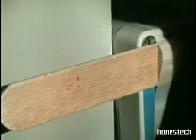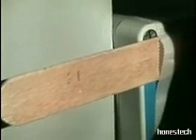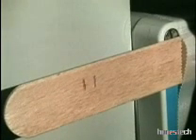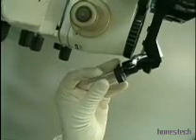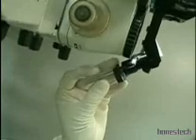Thanks to the AccuBlade, irregular incision lines don't occur, unlike those yielded with the micropoint. The swift beam sweep along the line reduces operating time. Because the sweeping speed is constant, the energy distribution is uniform along the entire length of the line. The AccuBlade can be used with an operating microscope or a handheld device. If the operating microscope is used, a joystick-controlled electrical motor can rotate the linear beam with an angular movement on the work area by guiding the flash scanner connected between the laser arm and the operating microscope.